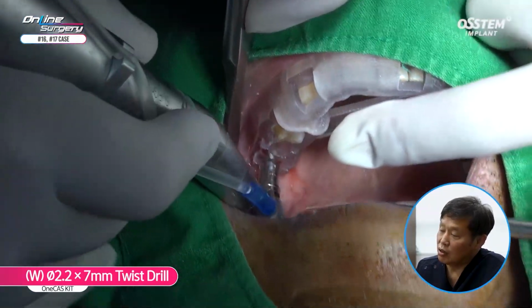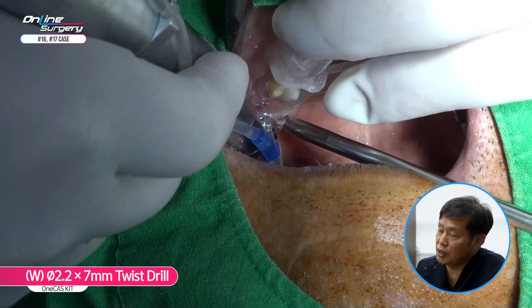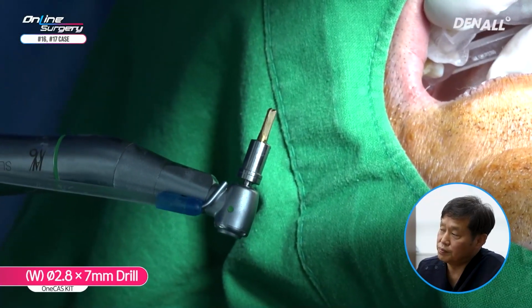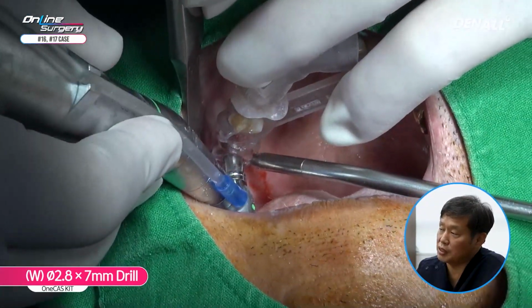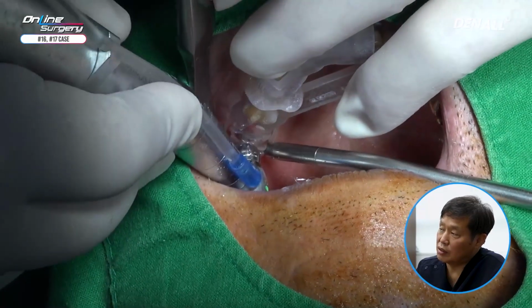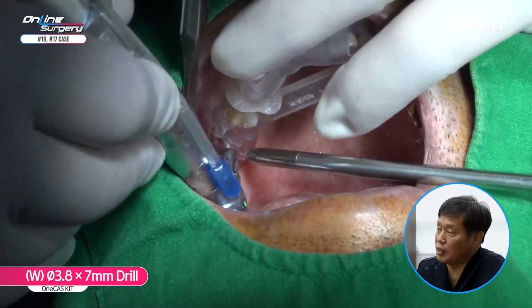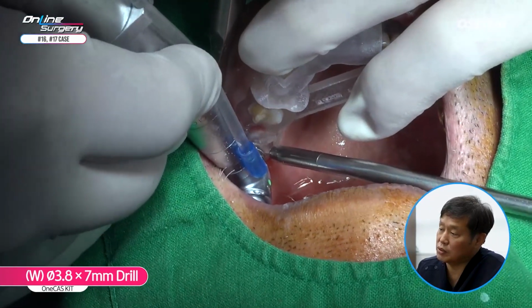Next, moving on to number 17. You can see a 2.2 by 7 millimeter twist drill is used without stopper. A 2.8 by 7 millimeter drill without stopper is used to drill up to 7 millimeters. The sinus floor was slightly penetrated at 8.25, so a 3.8 by 7 millimeter drill is used.